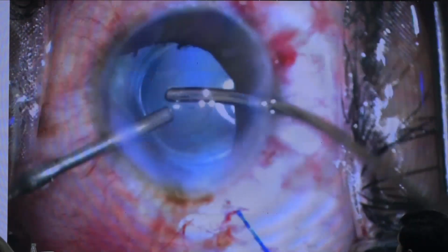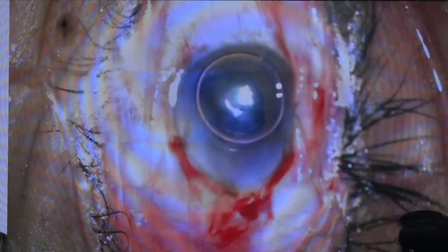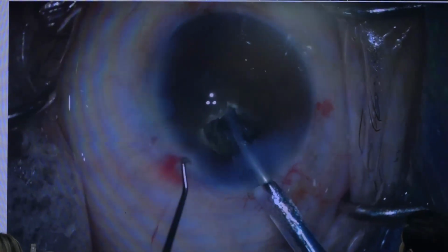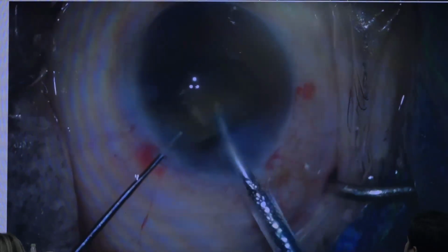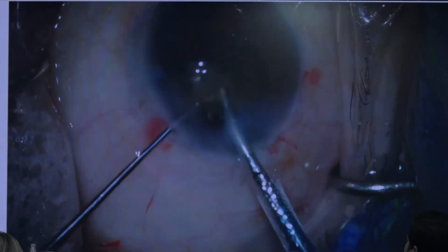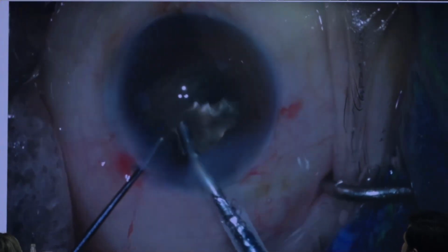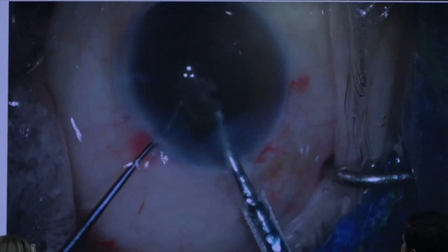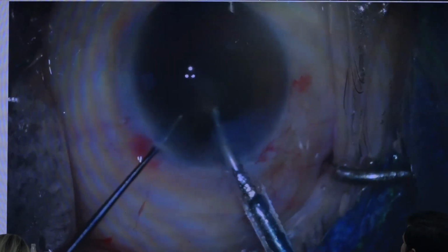And you can see the bluish tinge because the dye has gone posteriorly, and that is common to happen in these cases. And when you gain more experience, and depending on the individual eye, you can also actually get away without any iris hooks and maintain a very crystal clear cornea till the very end of surgery. And that is basically just to show that it's a whole spectrum of your surgical expertise and the configuration of the eyes that can decide which approach you are going to take.